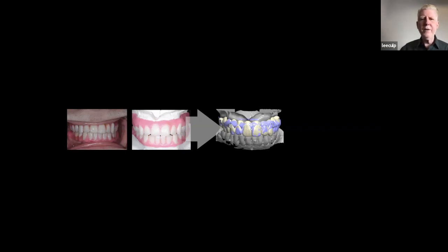And then I just started taking the modeling tool, the rubber tooth tool, where I could stretch and pull the data. And I just pulled it down, pulled it over the tissue, pulled it into the vestibule, pulled it over the lingual, trying to keep the teeth as accurate as possible, but just taking that data and really pulling it until I had a denture base. And you'll kind of see how it all works out here.